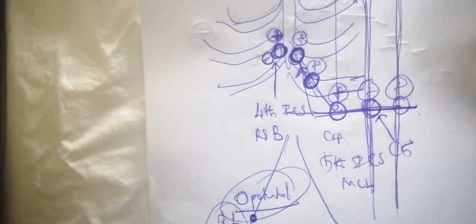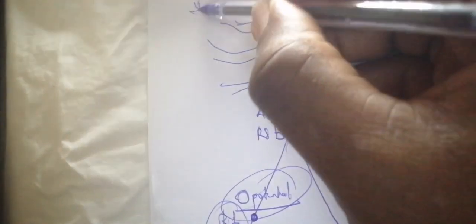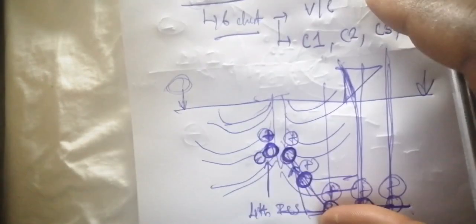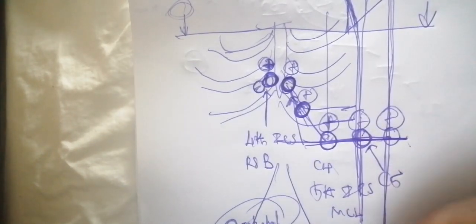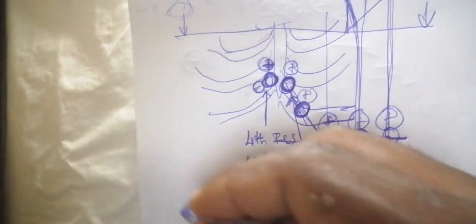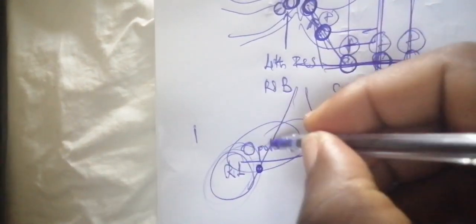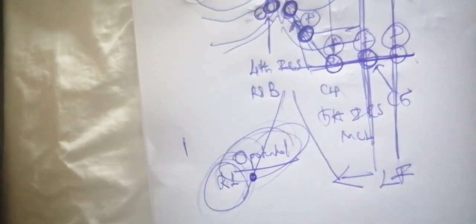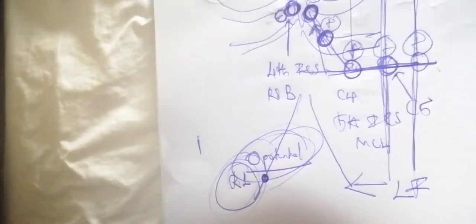So that's why when you visualize an ECG, for the ECG leads you're going to have one electrode placed on the right arm, one electrode placed on the left arm, one electrode placed on the left foot, and another electrode placed on the right foot. The electrode on the right foot is the reference point, and that reference point is the zero potential. Is it clear for the different unipolar limb leads?